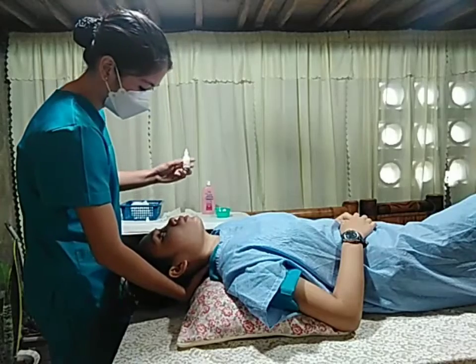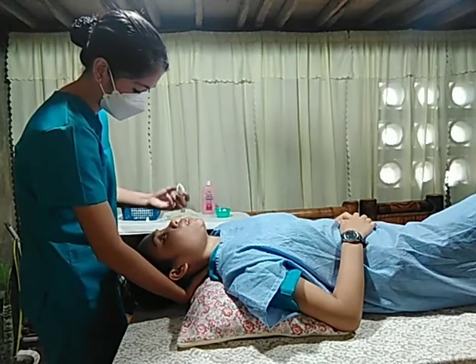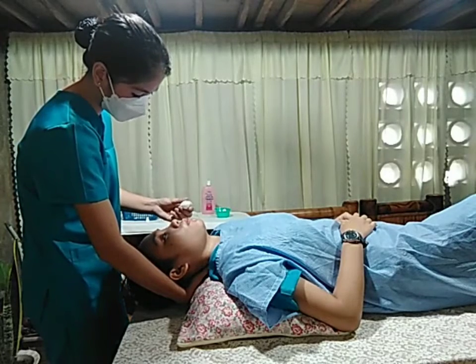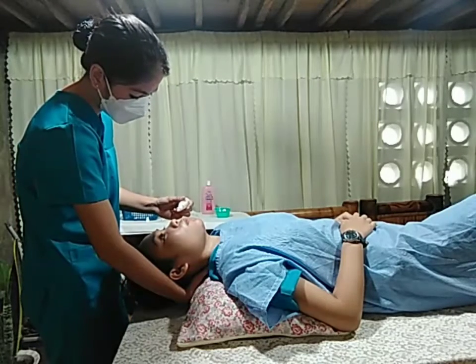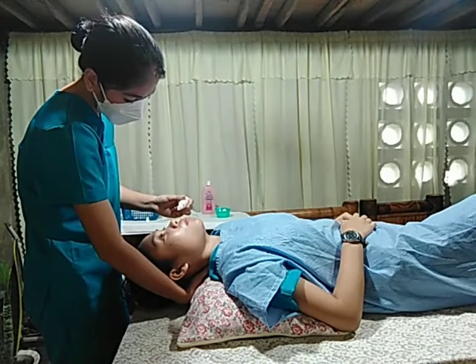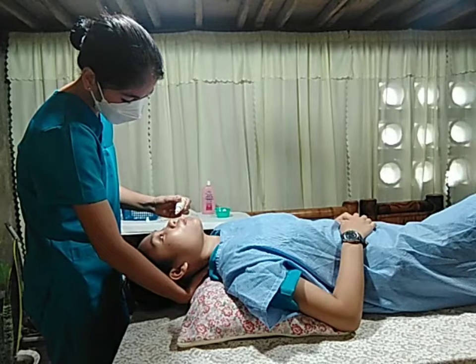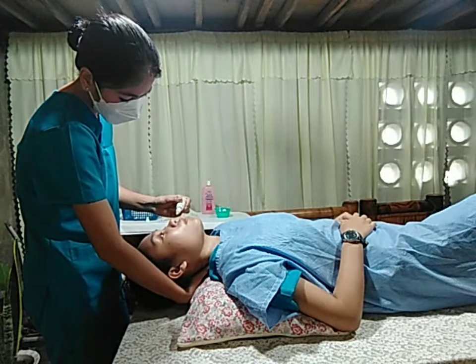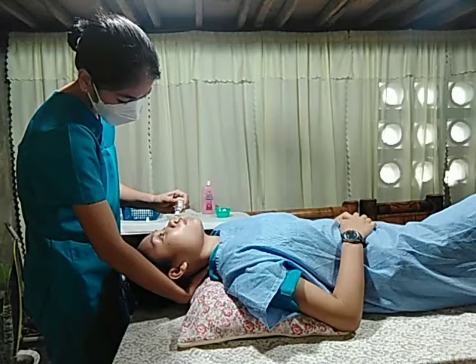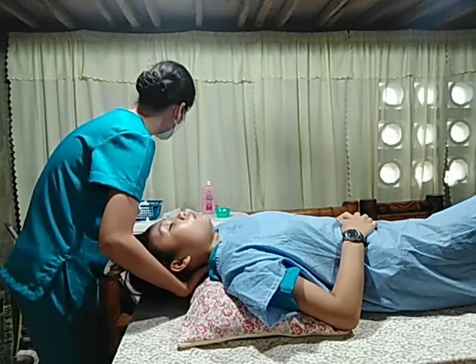Next, ma'am, I will place the dropper, and breathe through the mouth. Okay. So I'm going to place the dropper 1 centimeter above the nares to avoid contamination. 1, 2. Done.